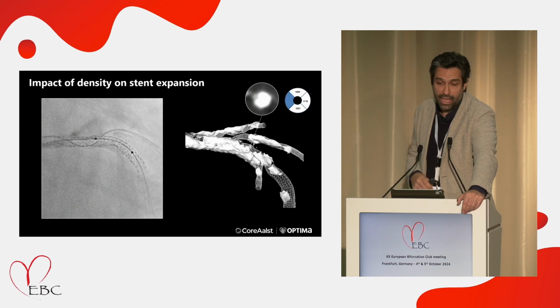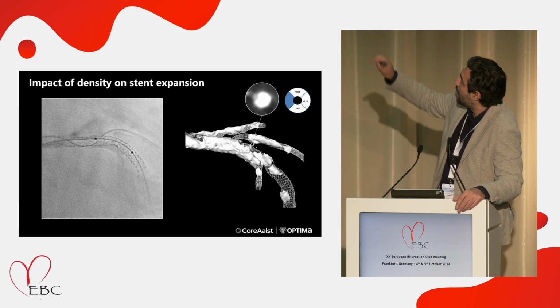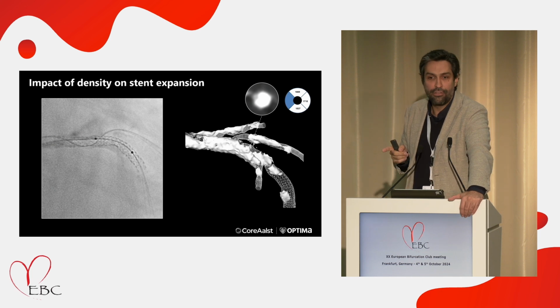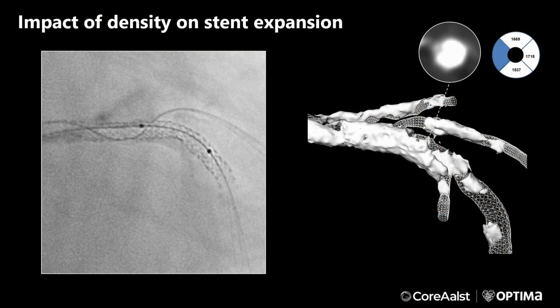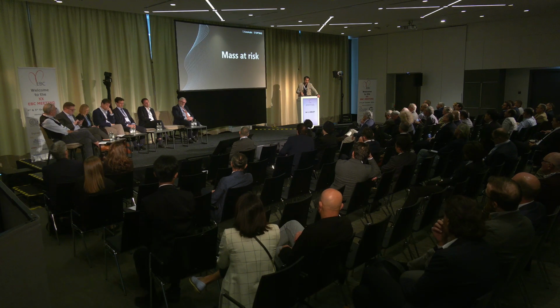Now, I'll show you a couple of cases that we had to deal with. This is basically a mid-LAD. And what you see here, we call this calcium, when it's above 1.5K Hounsfield units, these are very difficult to open. Sometimes we deliver 80 pulses of IVL and we didn't open. When we have calcium above 2K, it is almost impossible to crack. And this is basically what we have been learning in the calcium arena.